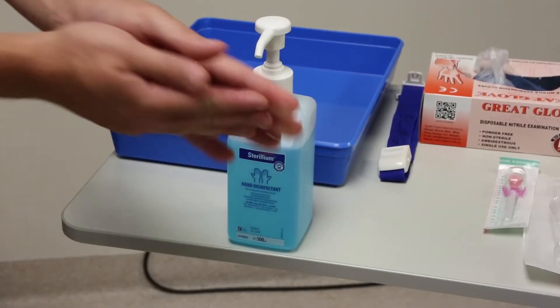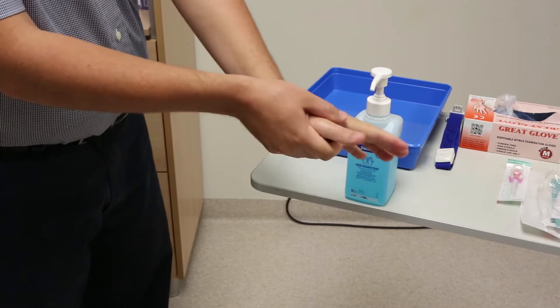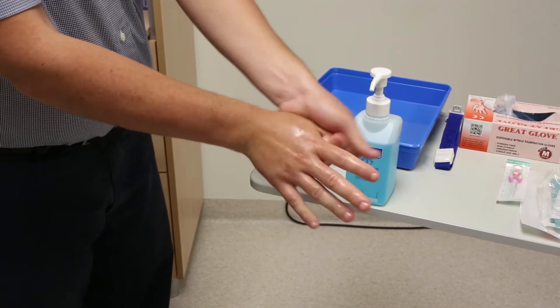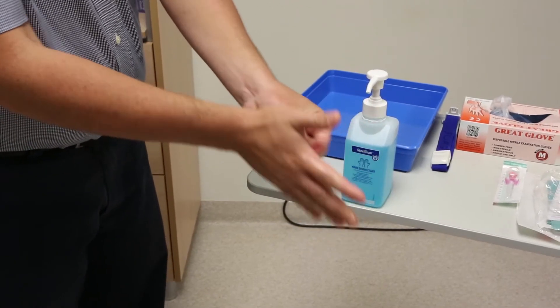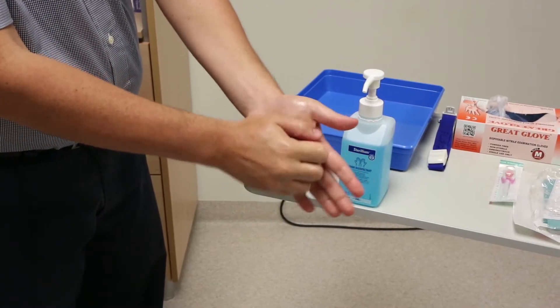Step 1. Clean your hands before starting the procedure using soap and water or alcohol hand rub. Hand hygiene is essential to break any chain of infection from contact with patients or fomites.